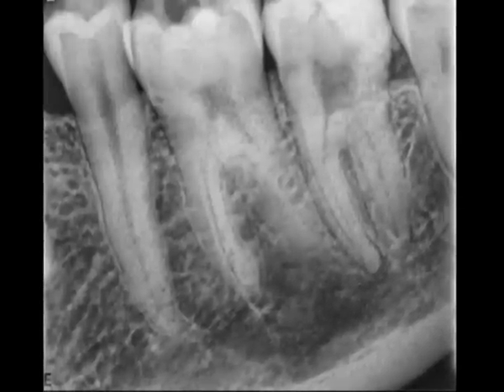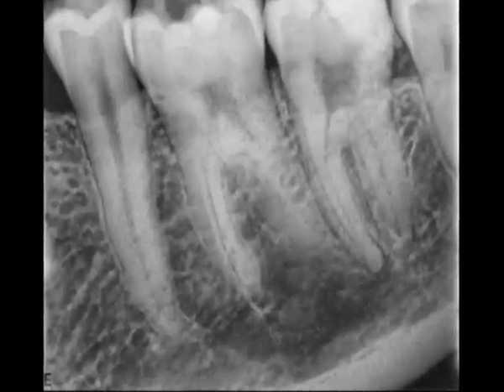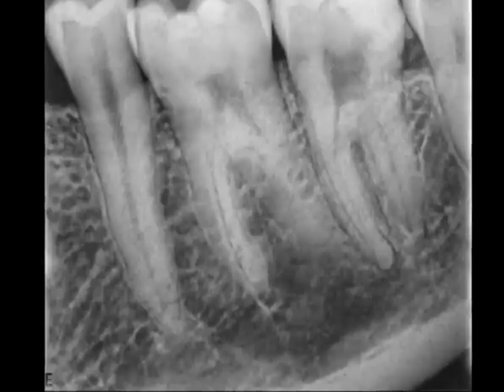The biodentine can quite clearly be seen on the post-operative radiograph, and you will note that it does not extend into the pulp chamber.